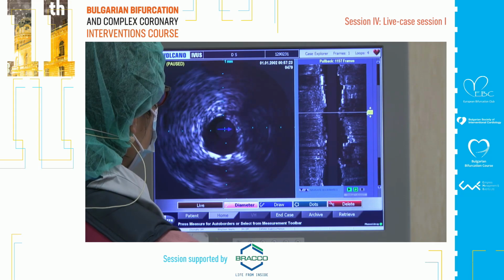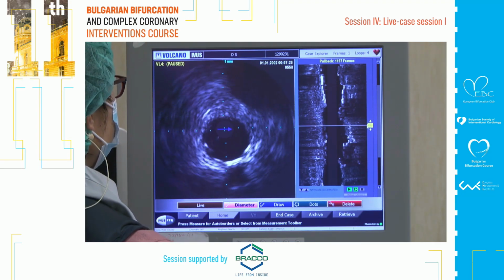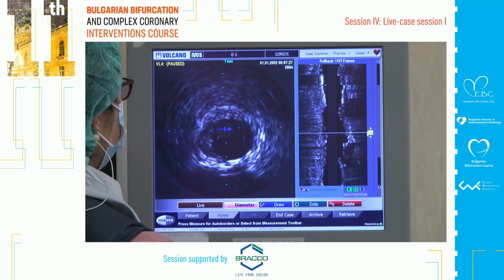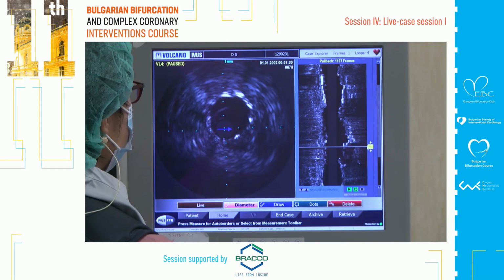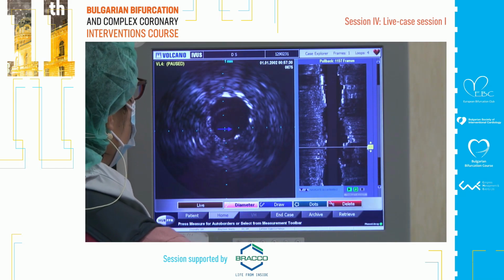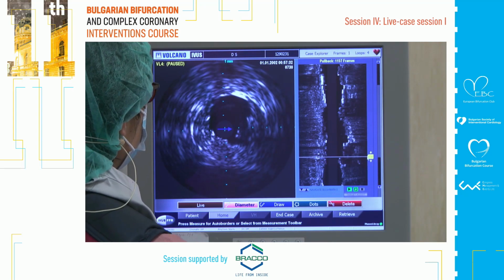It's well opposed. Still nothing. But you could make it bigger. This is originally a normal segment, and here it is dilated. Come back, come back. Okay, this is a calcified segment. The septa was okay. So this is the original soft plaque segment, and then come back.